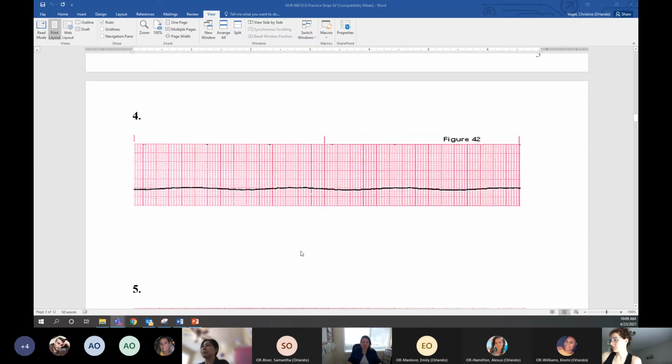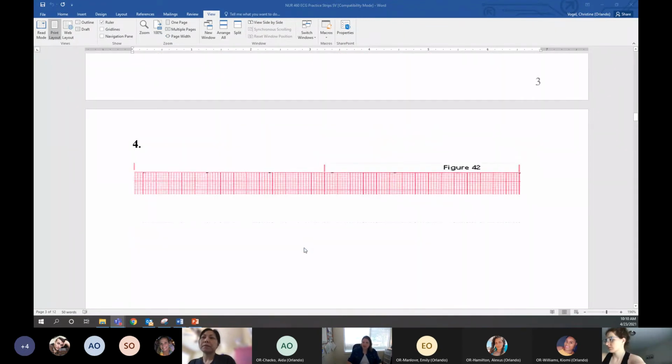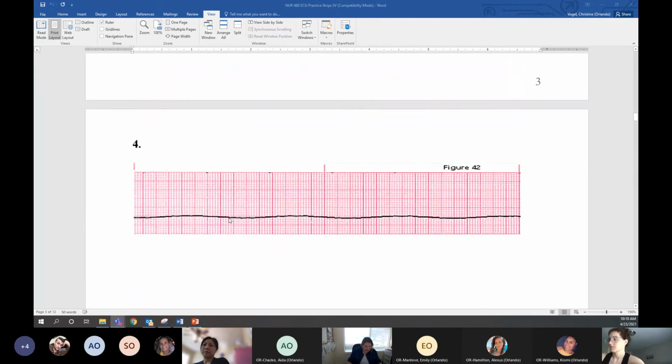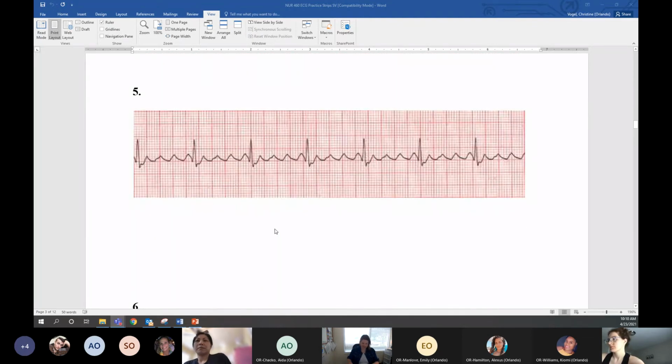Okay. Here we go. Asystole. Thank you. And what do we do for this patient first thing? Check the leads. Yes, please. Absolutely. Even with asystole, you see it's not straight like a board. It can be a little wavy. That's okay.